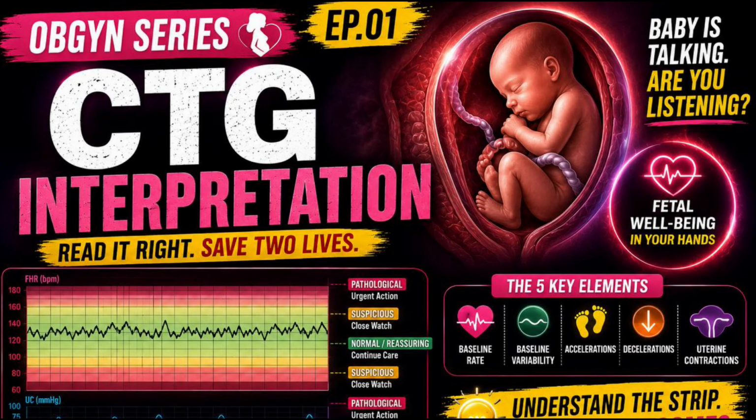Today we are going to learn one of the most important obstetrics investigations, the thing we call cardiotocography or CTG. CTG is not just a machine producing lines on paper. It is actually the baby's voice before birth. The baby can't tell us if it is getting enough oxygen or not, but the heart rate can. So whenever you look at the CTG, imagine the baby is talking to you through its heartbeat.